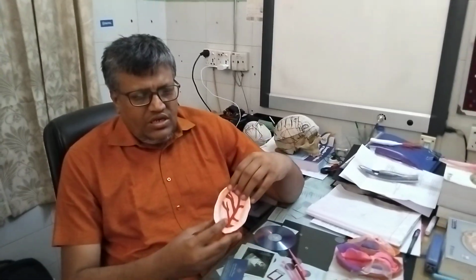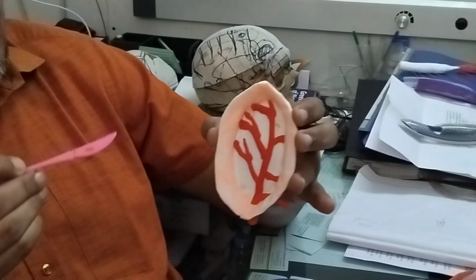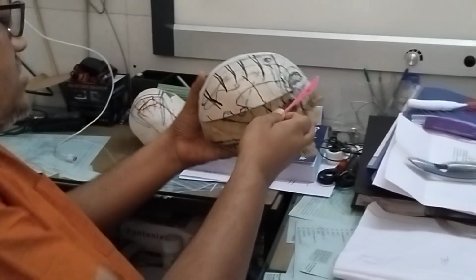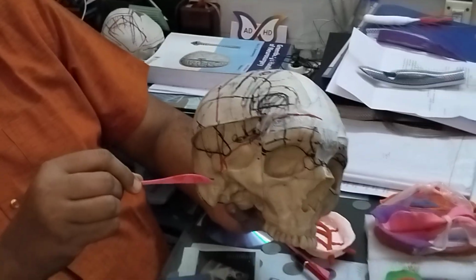clay, gloves, plastic, foam and paper. So now I discuss the operative technique. At first we give a skin incision. In our center we now use an incision over the scalp vessel. You see the course of the superficial temporal artery.